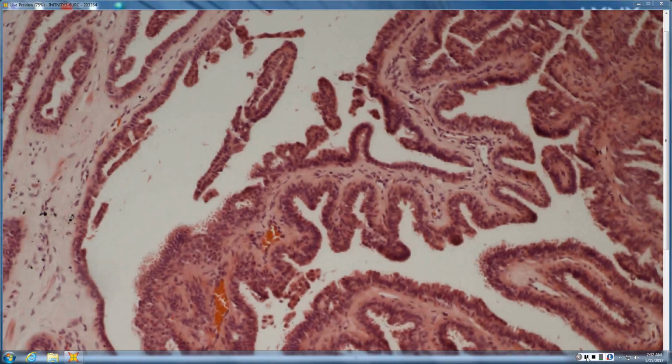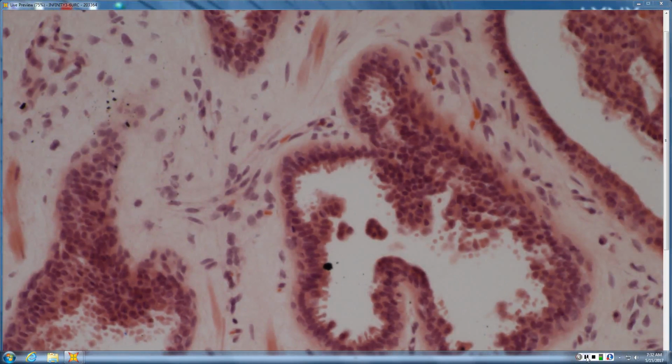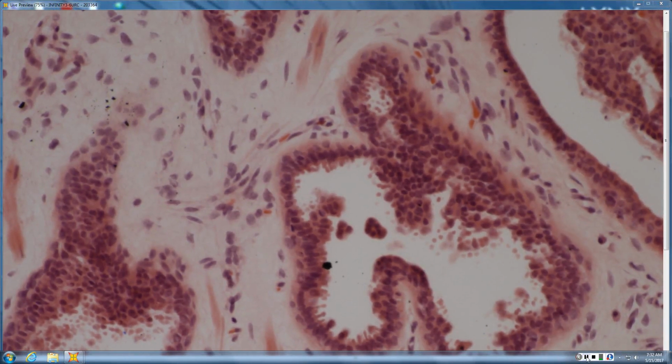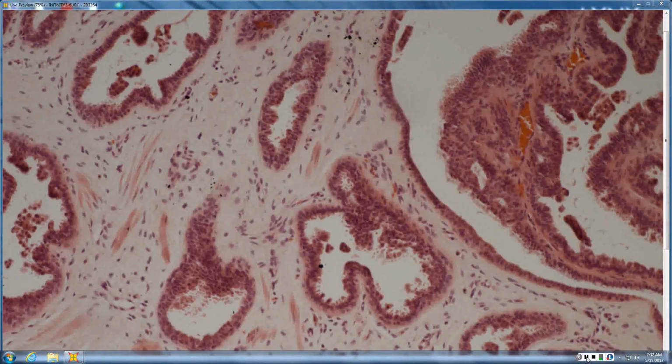So we've got something glandular. There's like a stratifying squamous or even maybe a columnar, loose columnar with decapitation secretion, which would be what kind of differentiation? Apocrine. And then surrounding it, you've got this layer of round cells that you could stain with something like P63 and they'd be positive. So that's a myoepithelial layer. So it looks like there's a myoepithelial layer at the base. Tells you it's not a MET, right? Because a MET wouldn't take its myoepithelial layer with it, right? So it could be DCIS or it could be something completely benign in the duct, but it's not a MET.